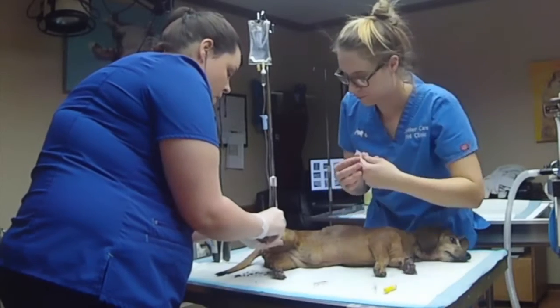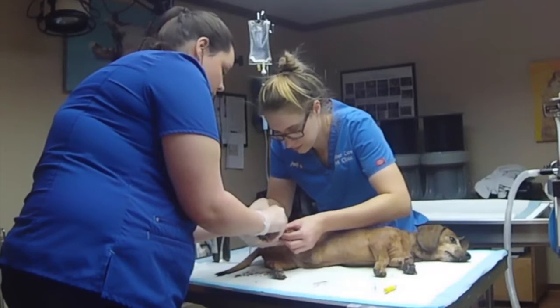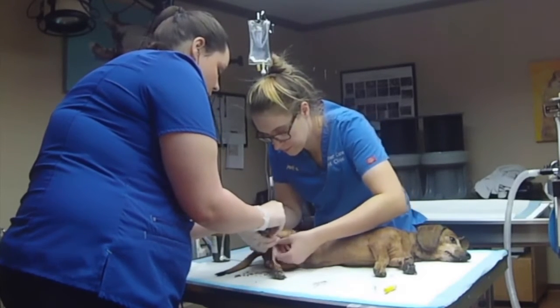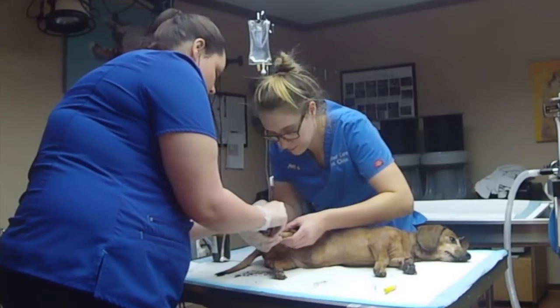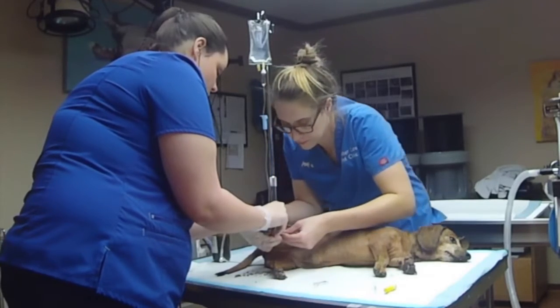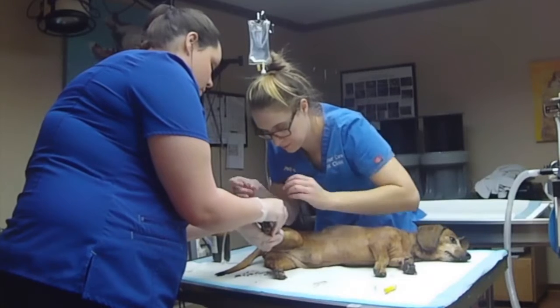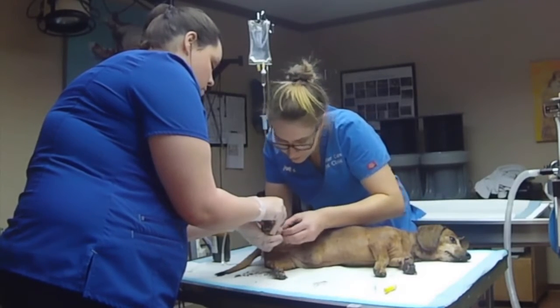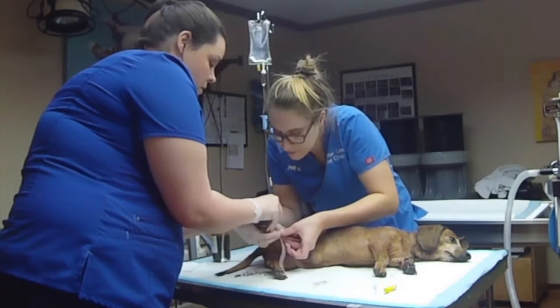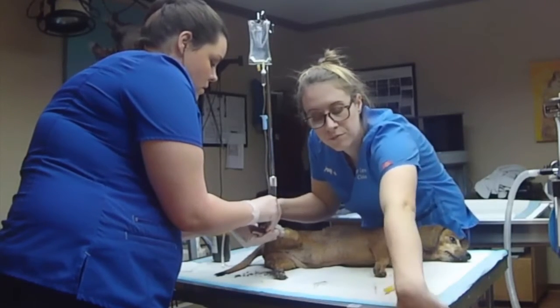We're going to tape it in and secure it with 1/2-inch tape first, and then we will go to 1-inch tape over the top after we do two 1/2-inch tapes. And then you can secure it with vet wrap, but since we were doing a dental on her, I want to make sure that we can get to the IV quickly if needed. And you want to make sure that it is screwed all the way in when taping in.